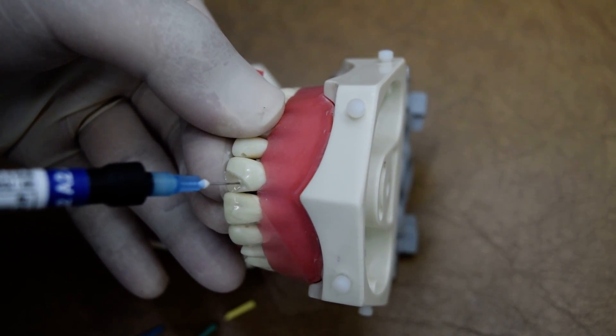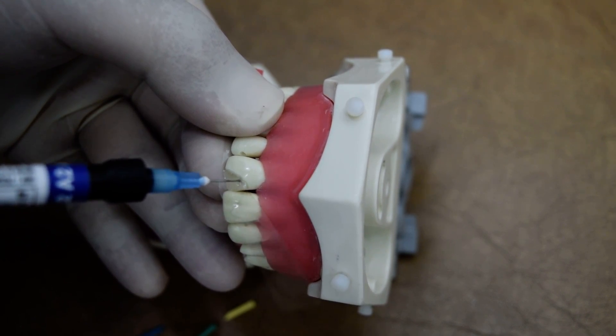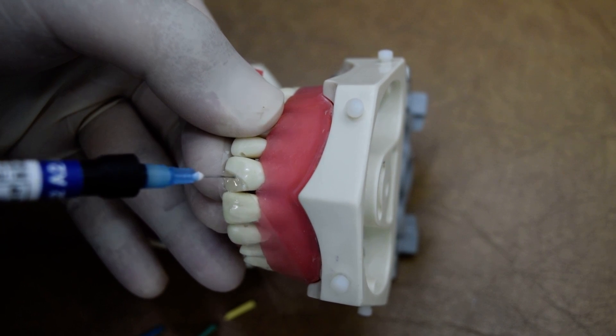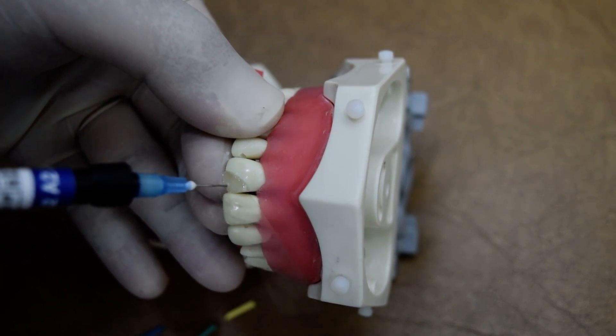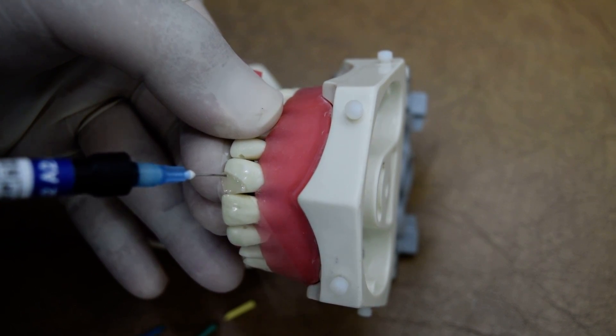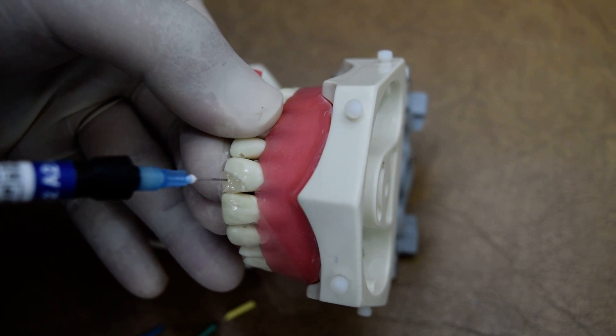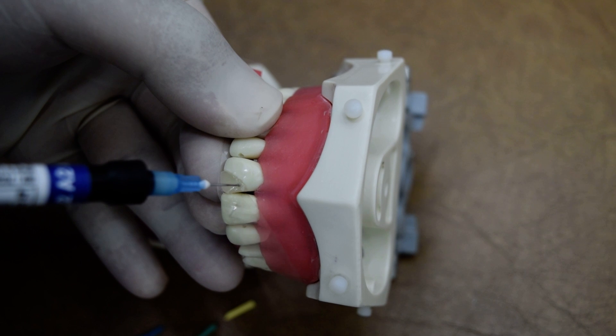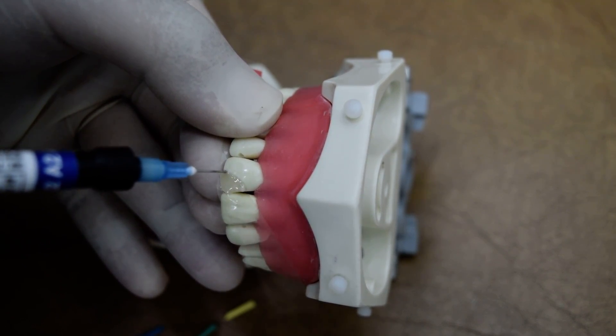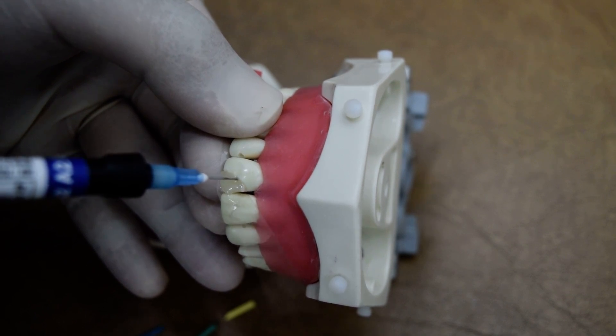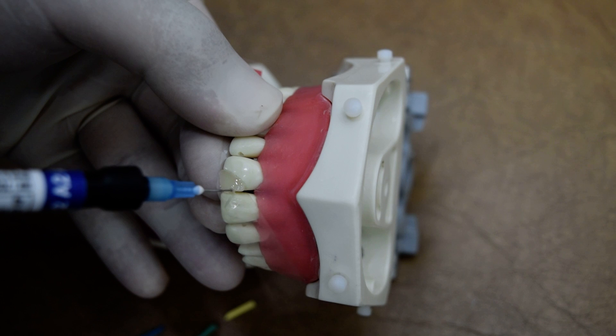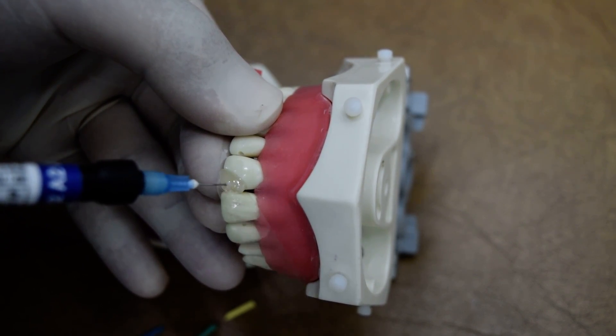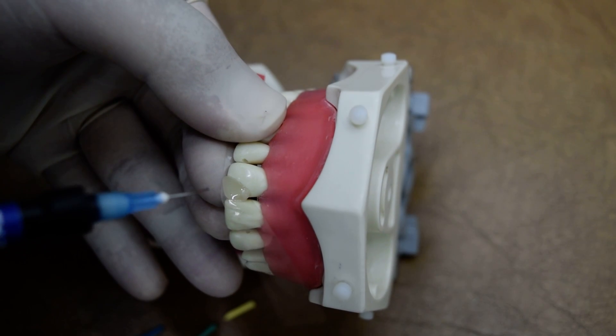The same technique here: that we need to keep the tip always inside the material. And I prefer filling in excess, especially incisally, so then we can trim it well and we will make sure that there is no deficiency or the incisal edge will be short.